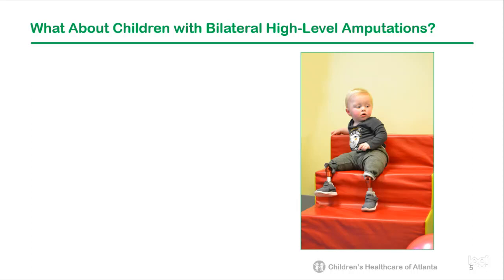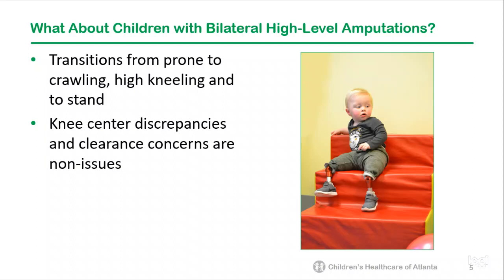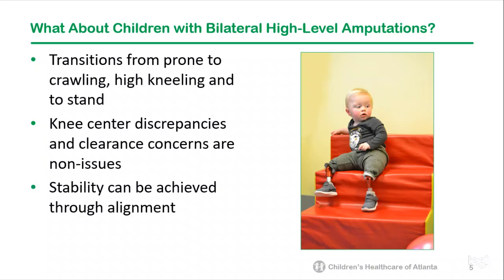These discussions are centered around those with unilateral involvement. However, the need for mobility for transitions are even more evident in those with bilateral involvement. Because knee center discrepancies and clearance for components are non-issues, and stability can be achieved through alignment, at Children's Healthcare of Atlanta, we have been fitting those with bilateral above-knee amputations with the same early knee protocol as our patients with a unilateral above-knee amputation.